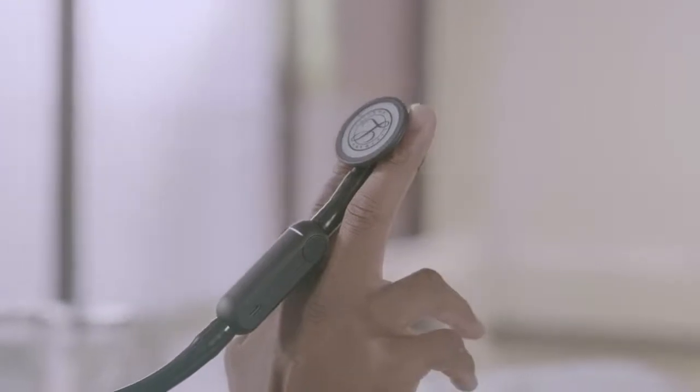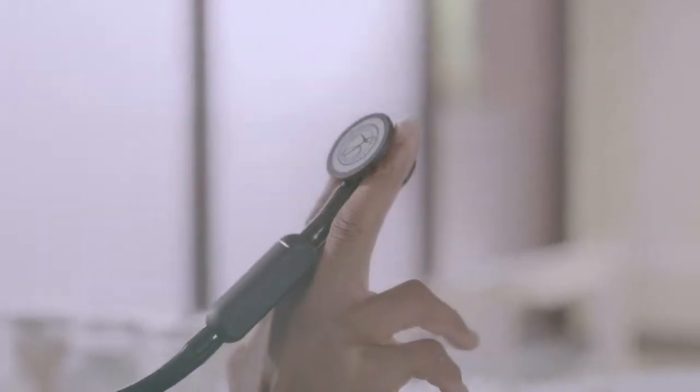Let's walk through the basic features of the Lippmann Core digital stethoscope so you can confidently use it in practice. Out of the box, the Lippmann Core stethoscope functions as an analog stethoscope. When it's powered off, you can use it to auscultate in analog mode. The stethoscope has a double-sided rotating chest piece with adult and pediatric diaphragms.